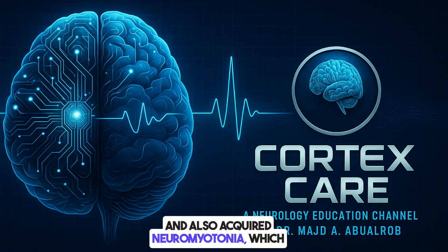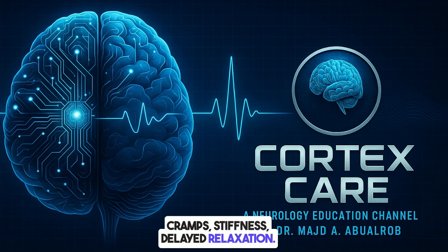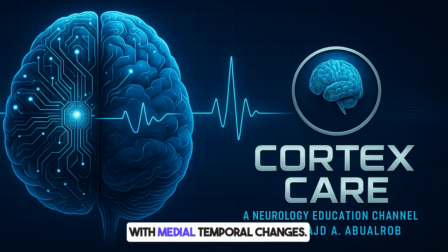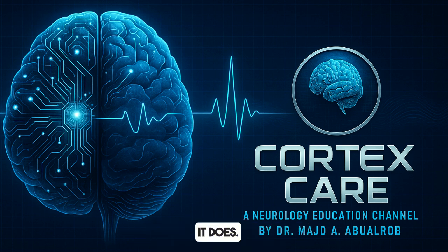And also acquired neuromyotonia, which is more focused on the muscle cramps, stiffness, delayed relaxation. But again, limbic encephalitis with memory loss, confusion, seizures is also common, and symptoms can overlap. Right. Figure 3 shows a CASPR2 case, again with medial temporal changes. Looks quite like the LGI1 image. It does. And the MRI findings reflect that clinical overlap.